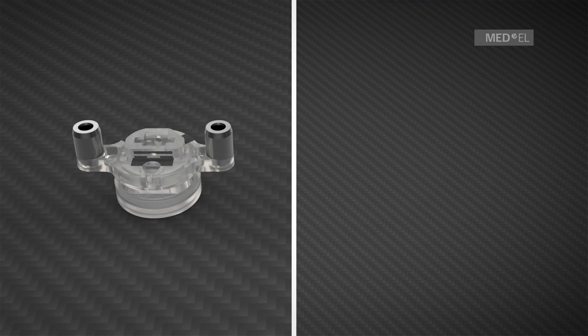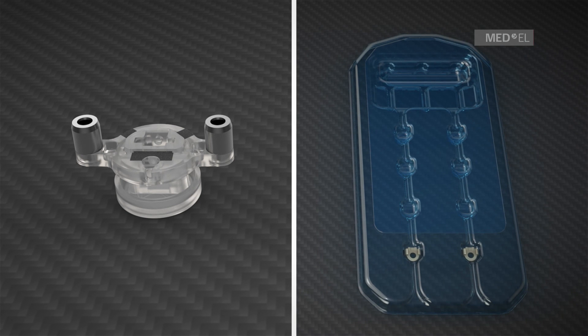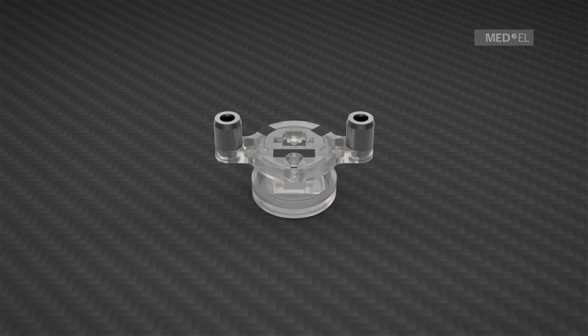The one millimeter BCI lifts are used when one line is visible. The package only consists of two BCI lifts, as in this case the screws from the bone bridge implant kit should be used. If there is no line visible, the bone bridge should be implanted without the use of BCI lifts.